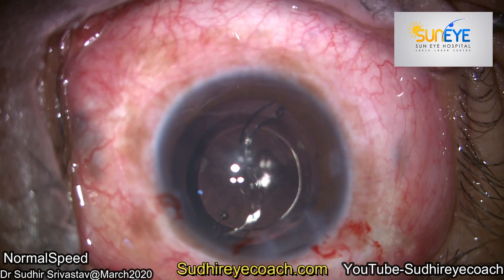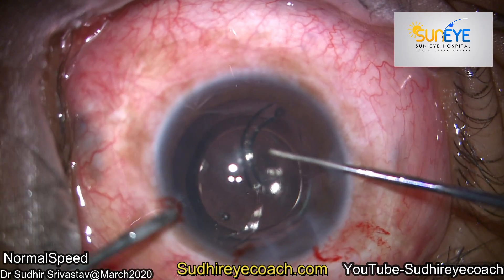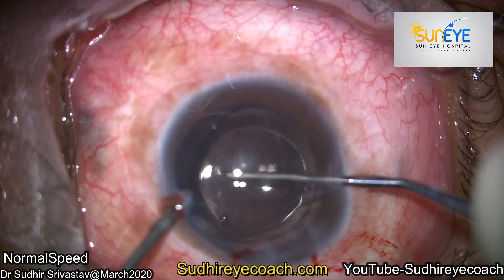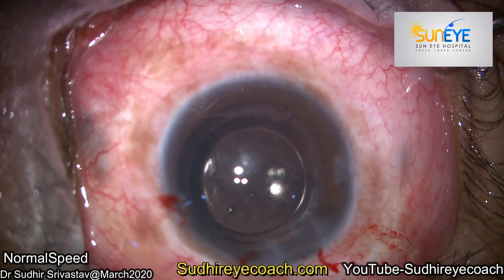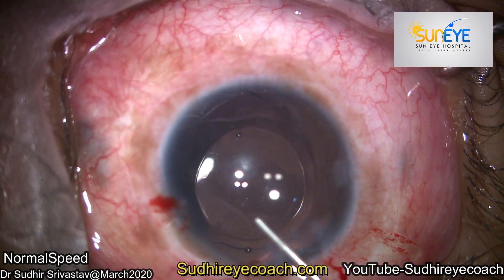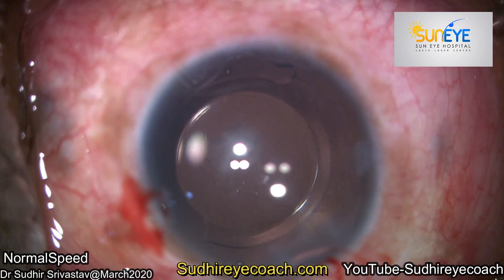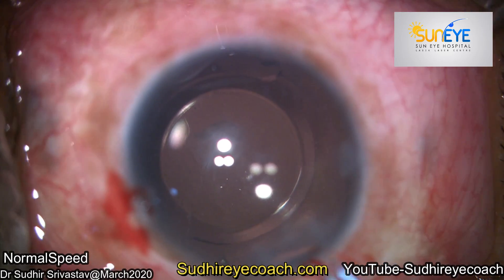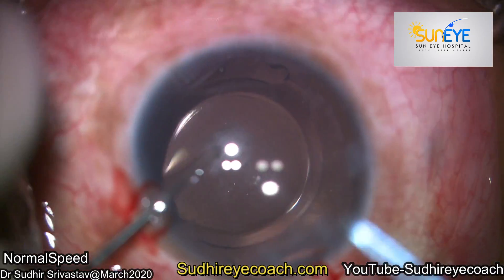I continued the surgery. I filled the chamber with cohesive viscoelastic and implanted the single-piece hydrophobic implant in the bag. After IOL centration, I then reconsidered what to do with the opacification and the silicon bubbles present in the vitreous cavity, just behind the posterior capsule, absolutely in the center.